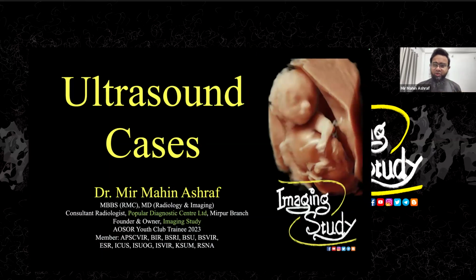So today we are going to talk about 10 ultrasound cases, and hopefully these cases will be interesting and beneficial for the beginners and interesting for the experts. So without any further ado, let's jump into the main topic.